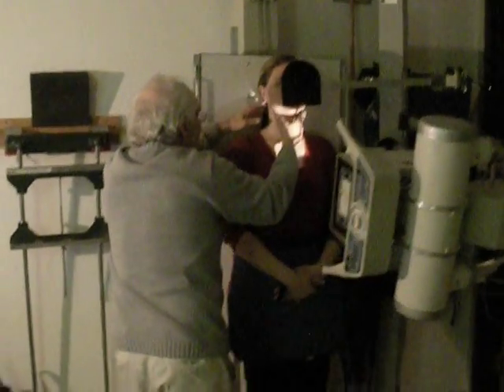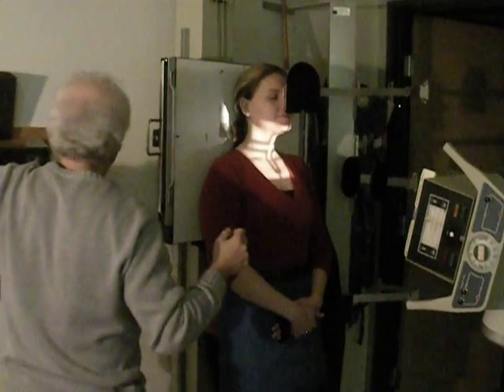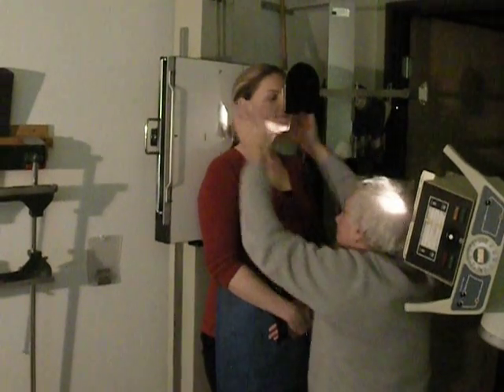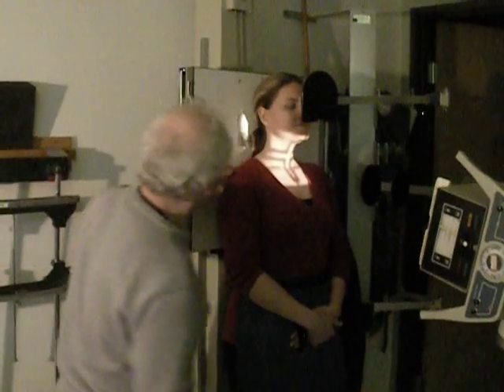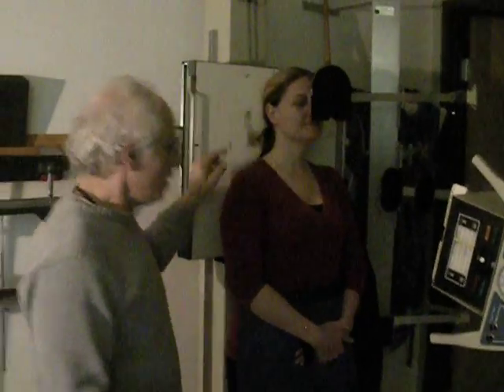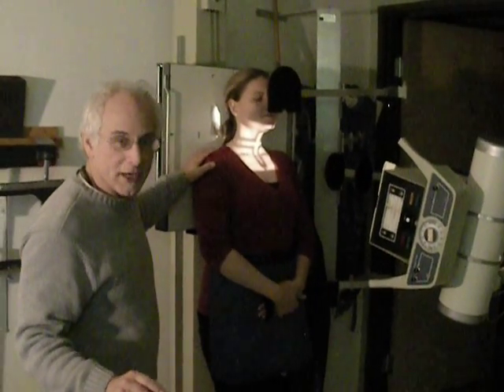And we'll make sure that this occlusal plane, which we talked about from the mastoids to the upper incisors, is perpendicular to the film. And that we can see a little bit of collimation on the mandible, which of course won't be diagnostic, but it tells us where we are. That's quite nice. And I think we're ready. We check this positioning from the side, this line, and we check the sagittal plane from the front. We see that this patient is well positioned, and I think we're ready to make our first exposure.